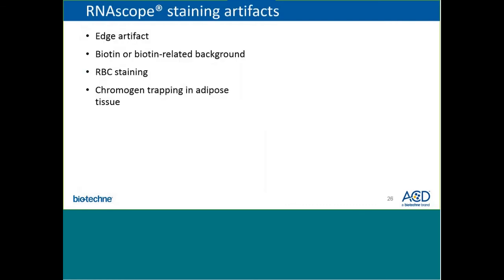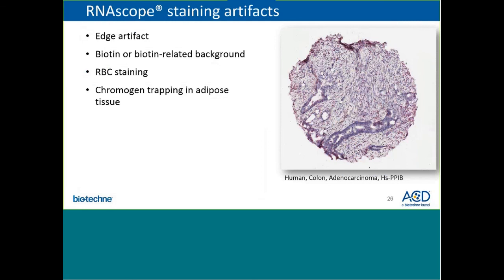While RNAscope is a very powerful tool, there are occasions when those using the technology are faced with various artifactual staining patterns. As with immunohistochemistry, there may be edge artifact where there may be more signal at the edges of the tissues. In this image, there is some minor edge artifact, and the focus should really be placed on scoring of the tissue in the cells away from the edge rather than at the edge. This is just a result of chromogen trapping at the edges of the tissues — whereas in the center, you get the true signal representative of the expression of those RNA molecules.